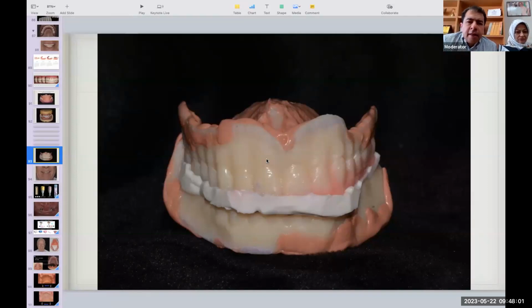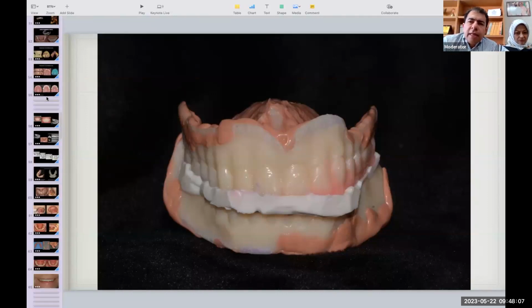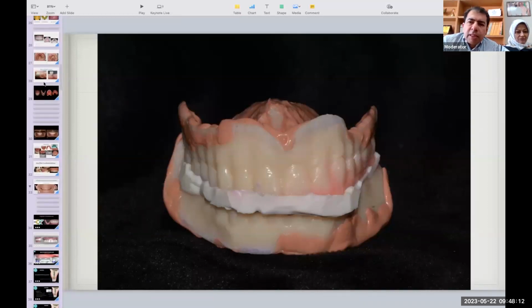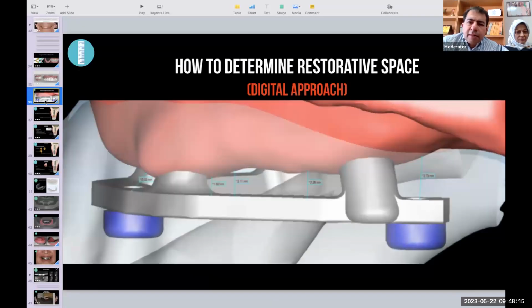Great. So, everything has become much easier. All right, let's go back to the overdenture that you delivered the abutments. It could be ball abutments or locators, depending on the system that you choose. And you mentioned that you scanned the abutments at the time of impression, soft tissue scanning. So how does it work? Do you inform the system of the implant system or brand of the attachment? How do you define it?